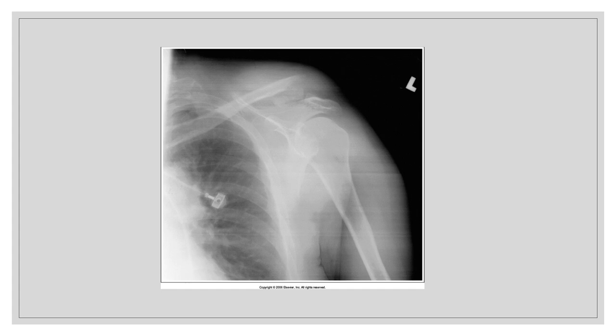What type of artifact? Equipment and external. So the lead on the chest is external and could be temporarily removed. However, the lines going across are grid lines, and that is equipment.